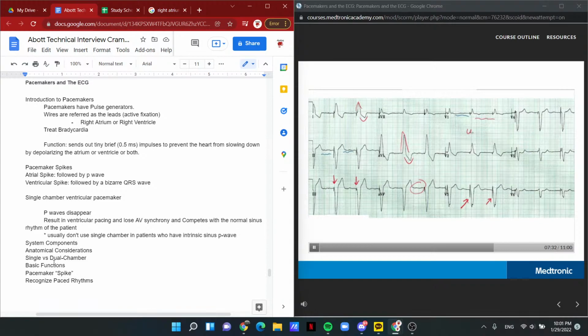Mention that there's underlying atrial fibrillation, but all you can say is that the AV node is conducting more slowly than the pacemaker because the pacemaker is really driving the rhythm. Now you can measure the pacemaker rate, and you should find it to be very constant. And here we have 300, 150, 100, 75, a little less than that, probably 70 beats per minute. Generally, pacemakers are programmed on the 5s: 55, 60, 70, 75, 80, thereabouts. But at least from one beat to the next, the ventricular pacemaker should be very regular.